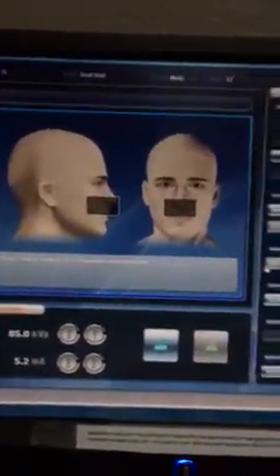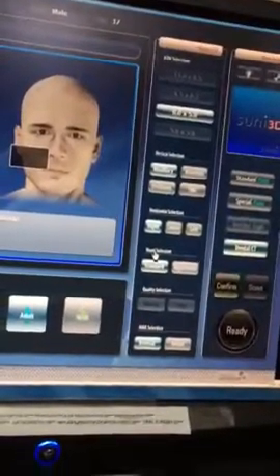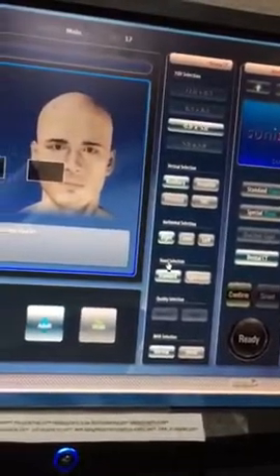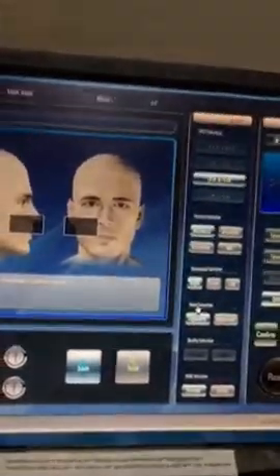Once you set this up and you know what tooth you want to take, you position the patient, and the machine sets itself up to capture the area that the menu indicates. This is up to the doctor, how much he wants. Voxel is a 3D pixel. Pixels are like pixels on a flat monitor, but voxel is the 3D component. That's what they call it.